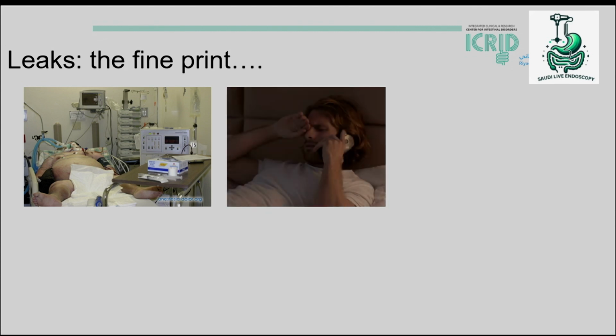When you have this patient, you know that for the coming 6-8 weeks at least, you will be woken up in the middle of the night. Even when you send these patients home with this massive stent inside, you just don't tell him, come to the ER. I give him my phone number if you have something, because he can have a perforation, he can have major bleeding. So you will be with this patient for several weeks.